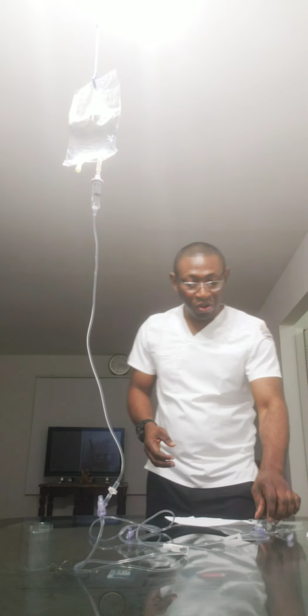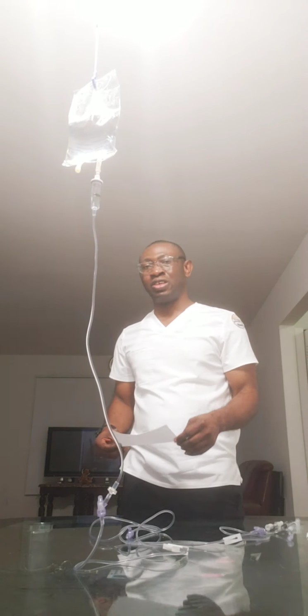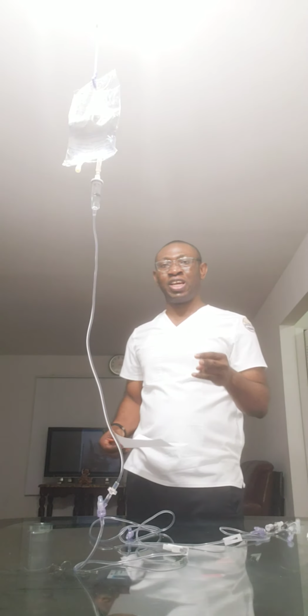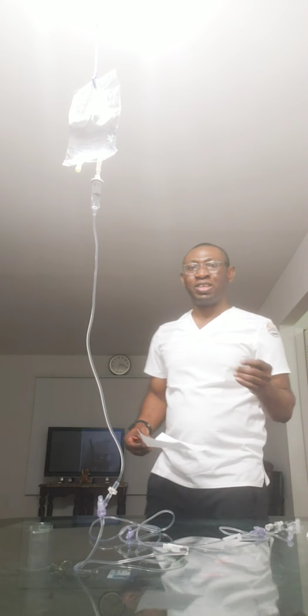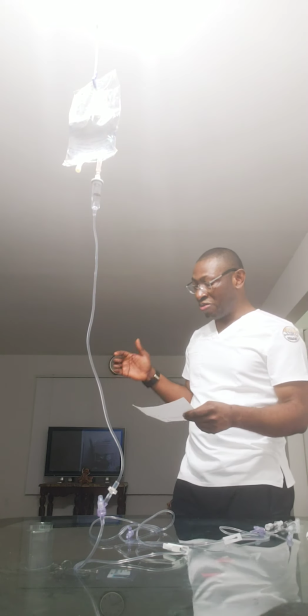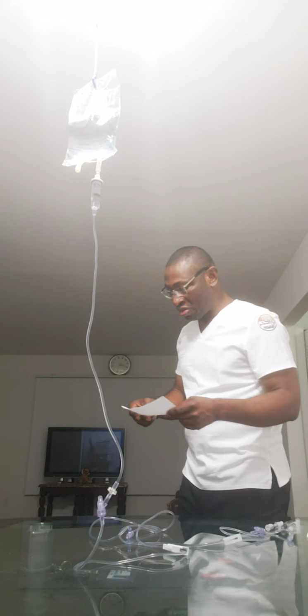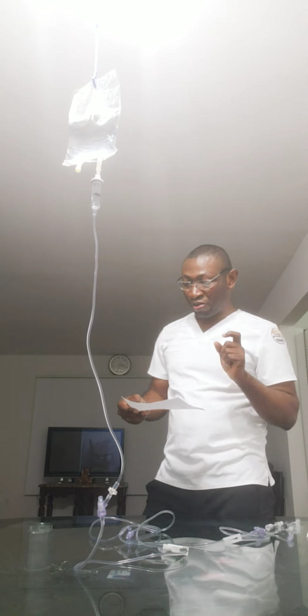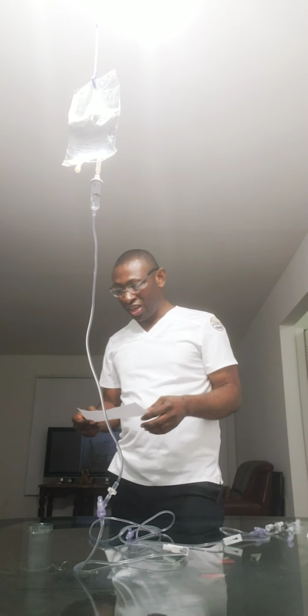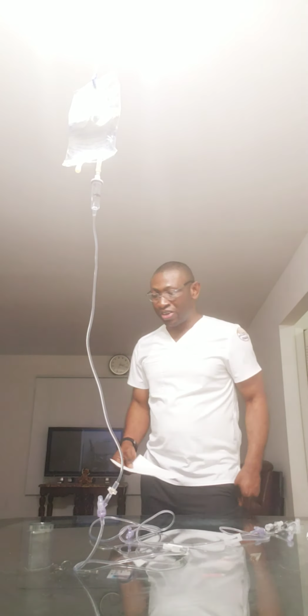Great. I'll be doing the third check by letting the patient know the 5 rights of medication: the right dosage, name, time, and route of administration. Hi, Mr. James. Based on the doctor's order, I'll be giving you Benadryl 25 milligram administered once via IV push. This is the right time for the medication. Are you ready for the medication?